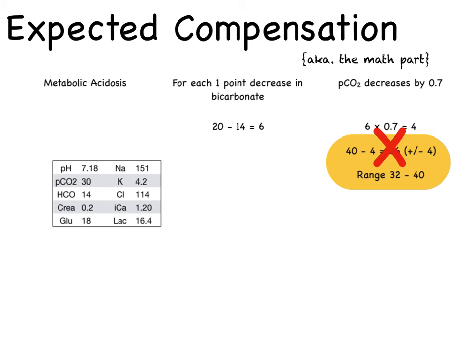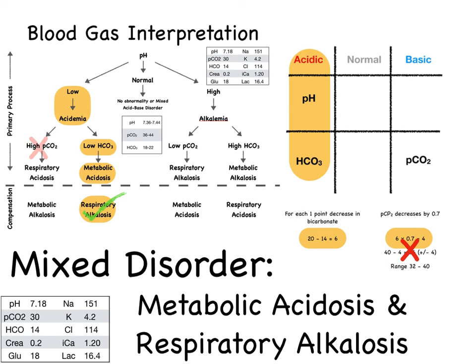In this case, the metabolic acidosis is probably from the major muscle activity from the seizures, and then additional contribution to the acidosis from poor tissue perfusion. And then I suspect the puppy was breathing really hard after the seizure, which gave him a respiratory alkalosis on top of what his body was doing to try and compensate for the severe metabolic acidosis. So, our final diagnosis, we have a mixed acid-base disorder characterized by a metabolic acidosis and concurrent respiratory alkalosis.